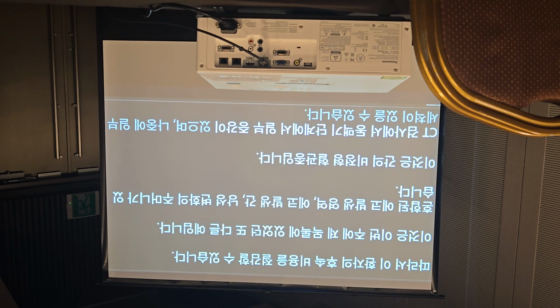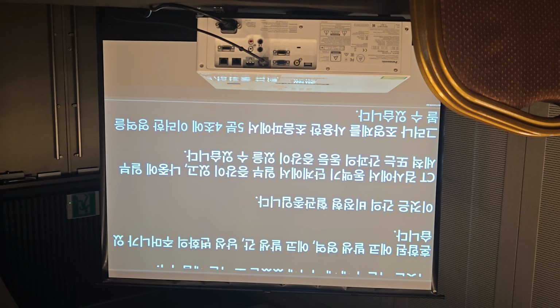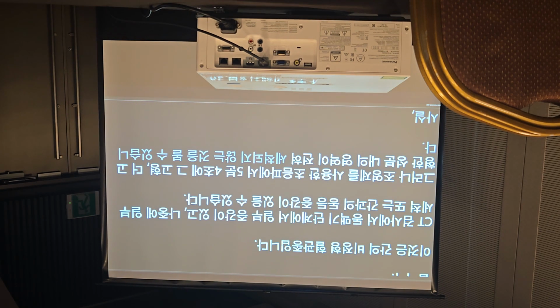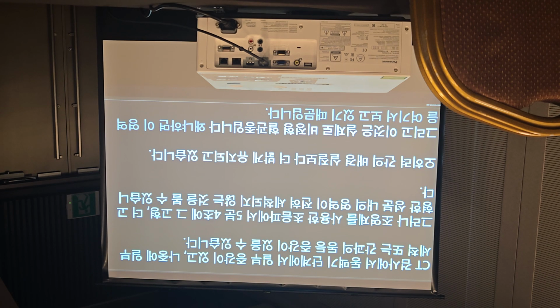But at 4 minutes on the contrast-enhanced ultrasound, you can see those areas within that more solid component not washing out at all. In fact, staying brighter than the background parenchyma of the liver. And this is, in fact, an atypical hemangioma because you're seeing this area here demonstrating that globular enhancement and infilling of that abnormality.